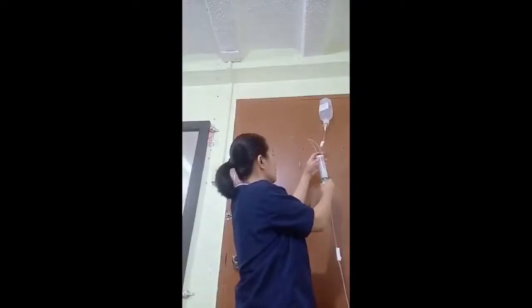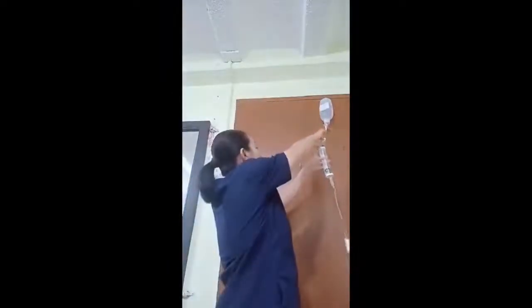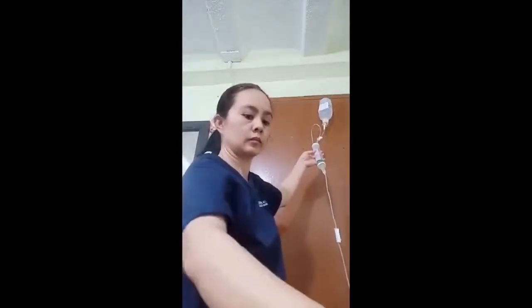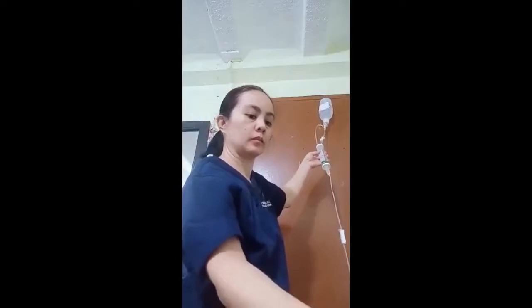So, IV medication is diluted with a small fluid volume, which reduces the risk of rapid infusion and prevents additional leakage of fluid into the Soluset. Air vents allow fluid in the Soluset to exit at a regulated rate.